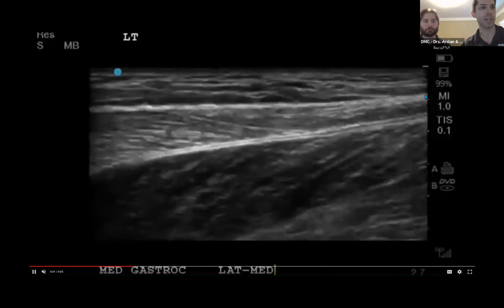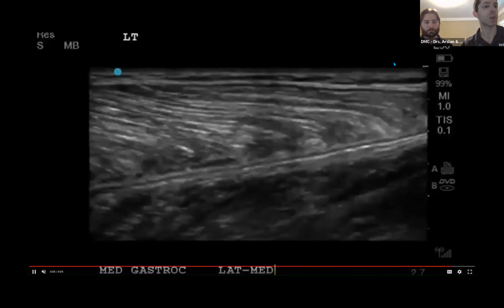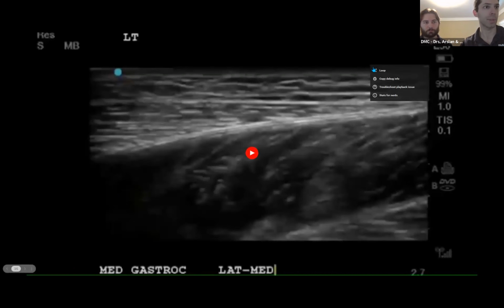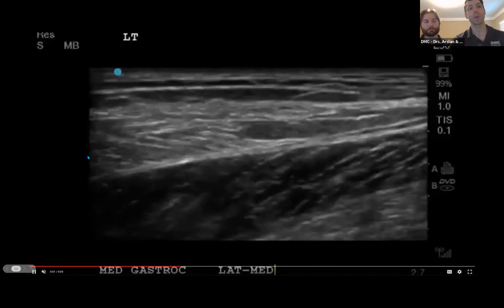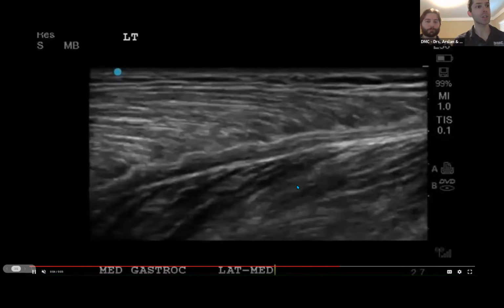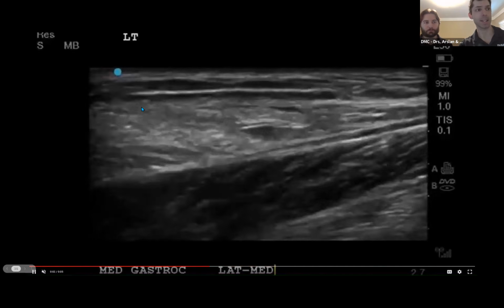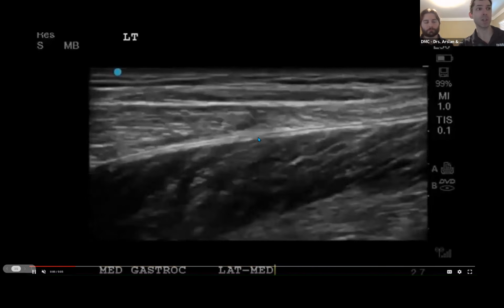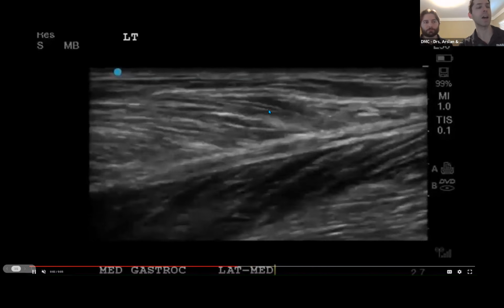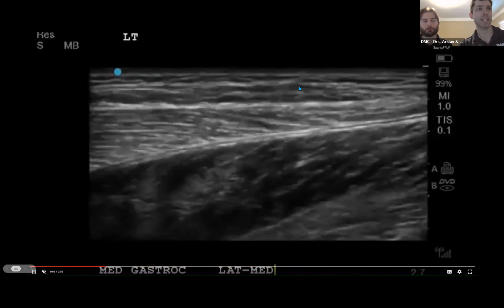So this is our patient's ultrasound of his medial gastroc, this dynamic scan. So what we can see here, let me actually just put this on loop because it's really important for our diagnosis. So as we had just demonstrated, this is the soleus muscle, its respective aponeurosis, the medial gastrocnemius. So we're looking for the homogeneity of the muscle fibers, but we don't see that. We see heterogeneity with anechoic and hypoechoic fluid. And we think that's consistent with bleeding.